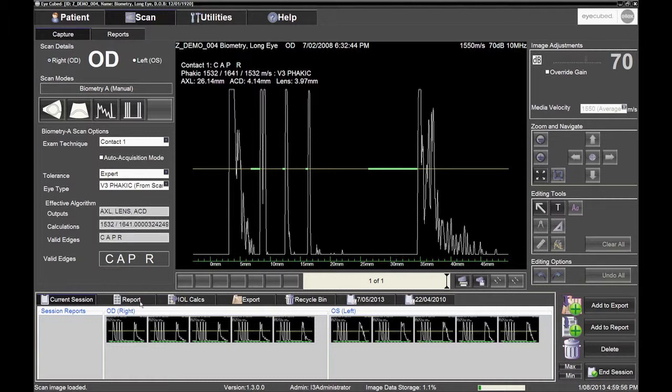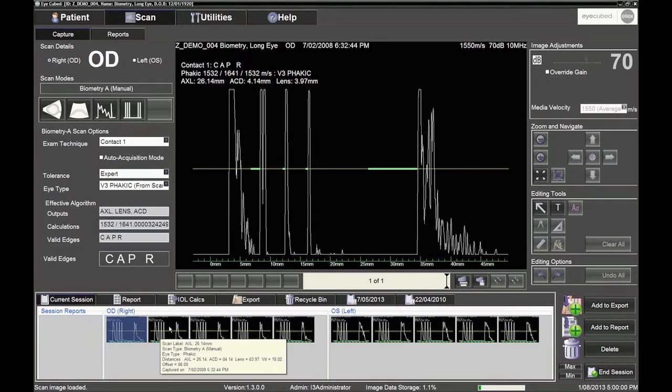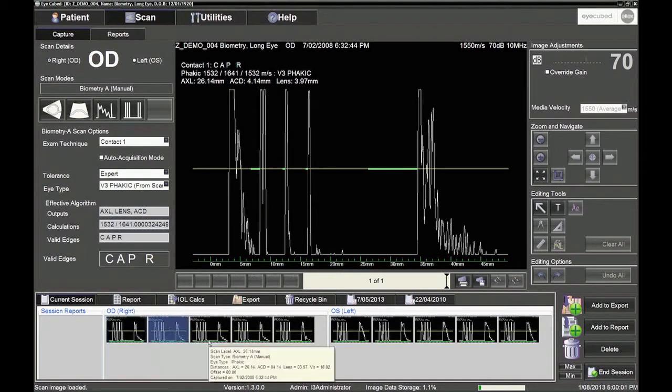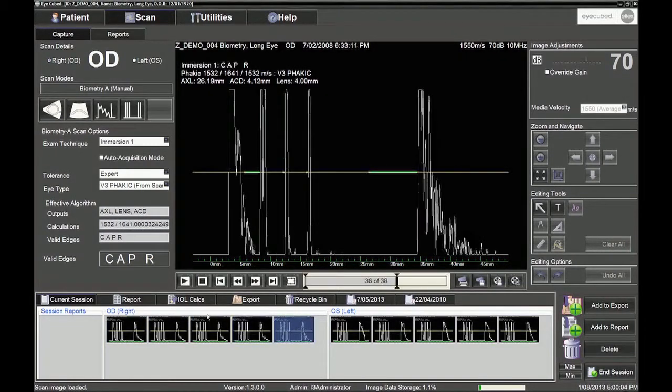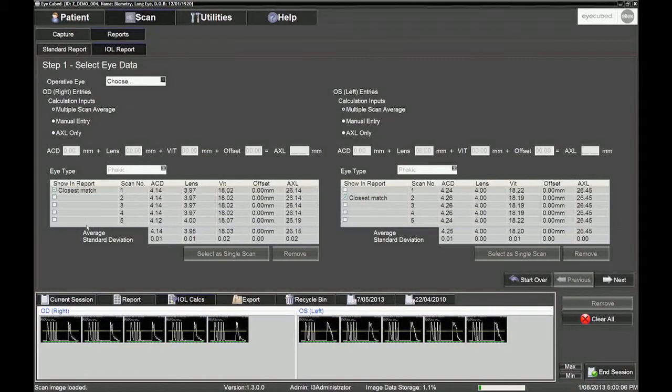Some users prefer to use an average of several scans, in which case, check each scan as before, and then ensure that the standard deviation is less than 0.1 mm.